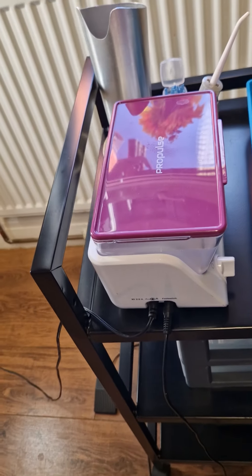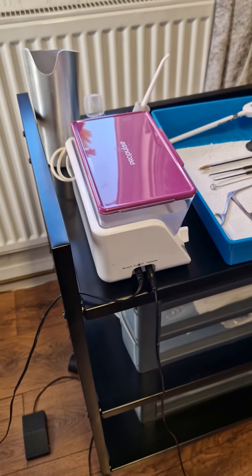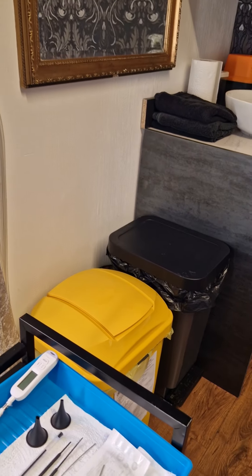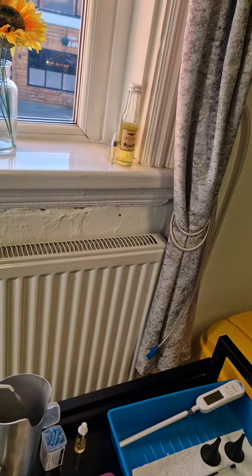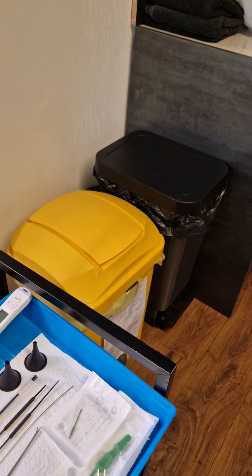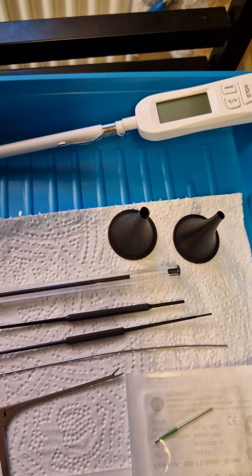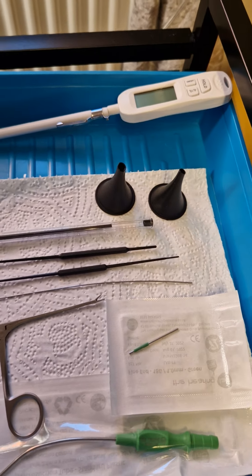The other tool we use is the irrigator — the Propulse. If you've ever been to your GP practice or seen a district nurse, this is probably the most common one they use. You put this under your ear, and it squirts a fine jet of water into the ear and the wax falls out into the cup. It's not used very often anymore but can be quite handy. We also use this thermometer to make sure the water is the correct temperature — nobody wants cold or hot water in the ear, it's got to be just right.